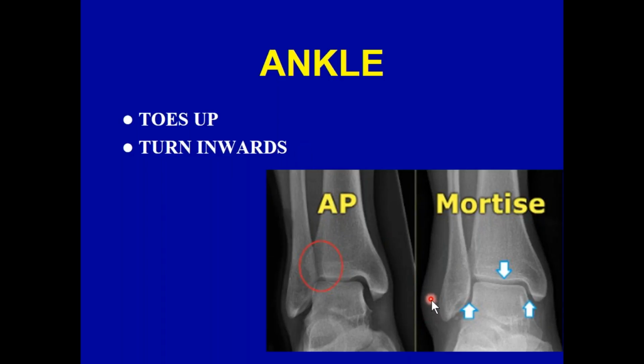This is the soft tissues adjacent to the ankle, and if I make you put your fingers on your lateral malleolus or the fibular malleolus, there isn't a whole lot of fat between the skin and the bone. So if you've had an ankle sprain and roll your ankle, it's this side that's going to be injured. We want to see that part because of the injury. So if we turn the foot inwards, we will see it optimally, and that happens to be called the mortise view. So inwards rotation gives us more information than just straight AP, but it's always done to patient tolerance. So that's the big takeaway point when you're x-raying the ankle.